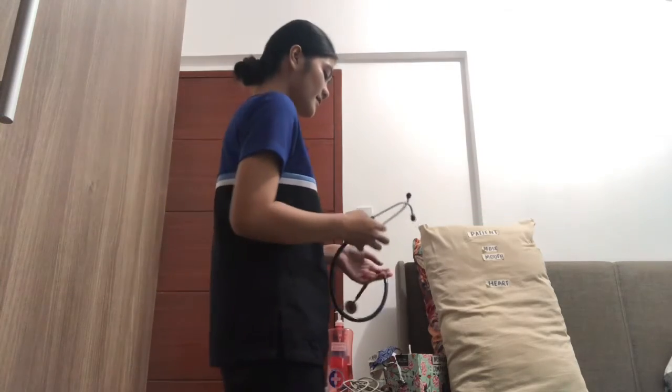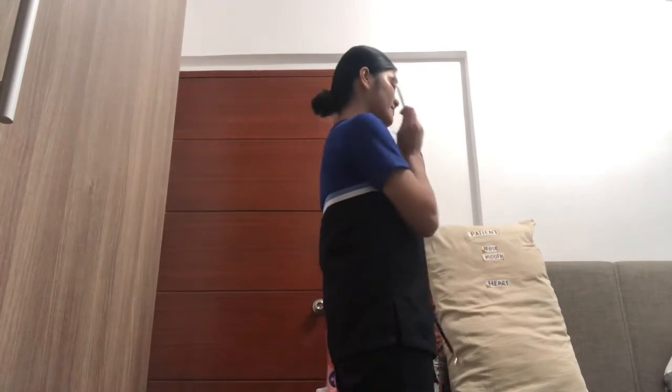By checking the heart rate, this is to be able to identify if the medication affects the patient, because as we all know, bronchodilators may cause tachycardia, palpitation, dizziness, nausea, or even nervousness.